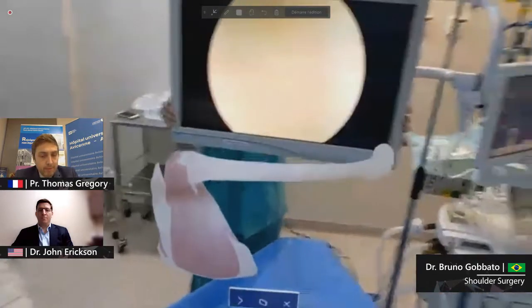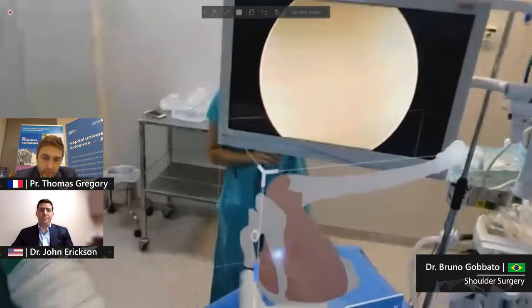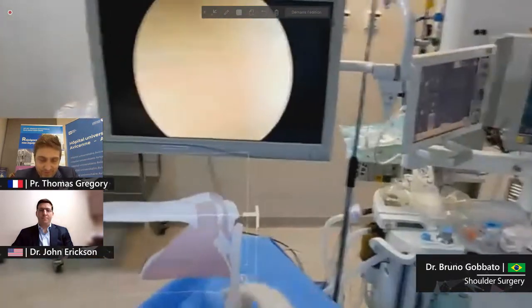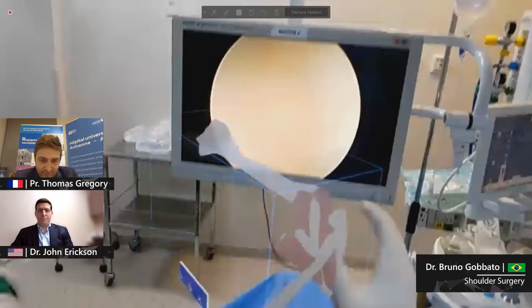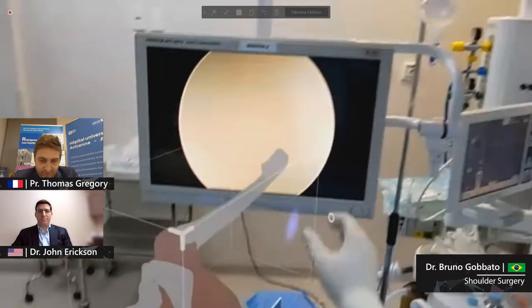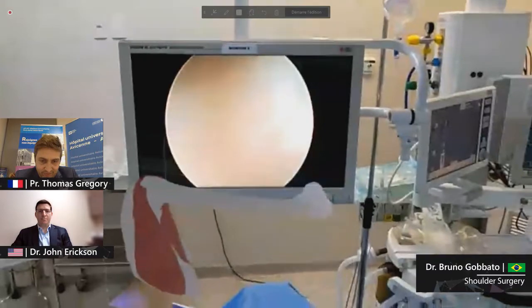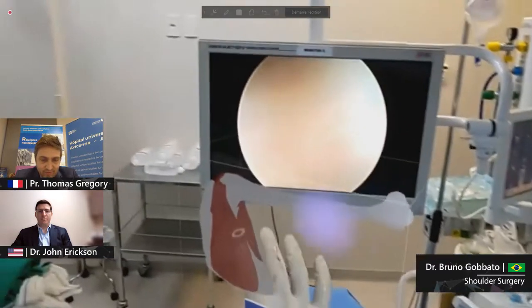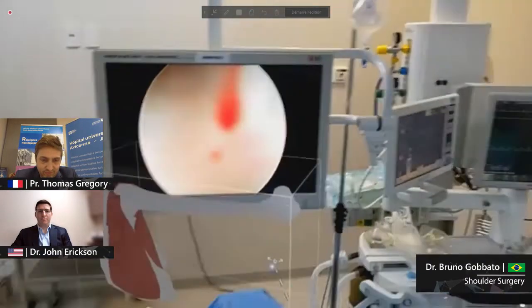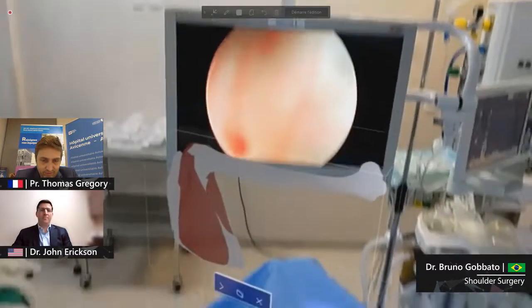For students, I really like to show this image from my field of view, because here I can place, of course, this is the right shoulder. This is not a left shoulder. We are doing a left shoulder arthroscopy. I missed that, but we can here see the curve. We can teach students what we are doing, the field of view we are doing, with these 3D holograms and showing them on the screen. And that's something that mixed reality is very important for, training young surgeons, students, and then you do the surgery by yourself when you are ready.